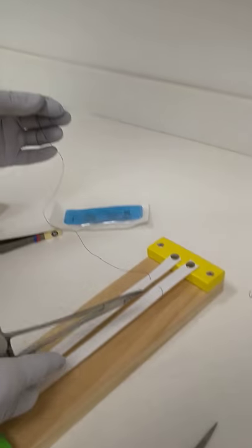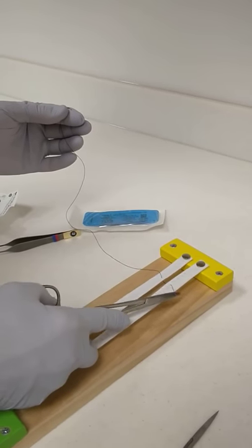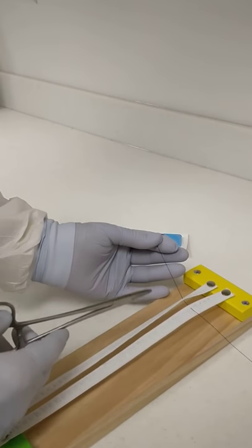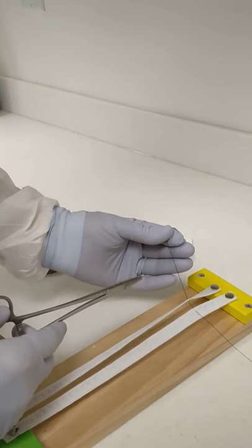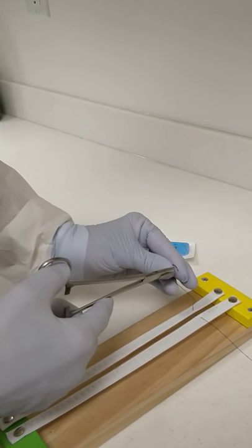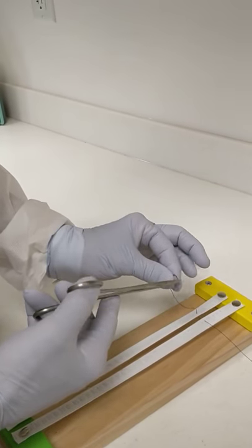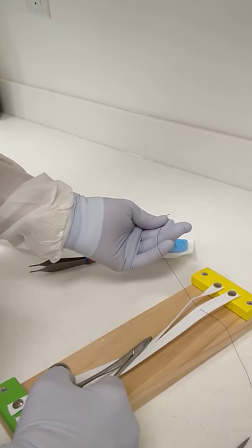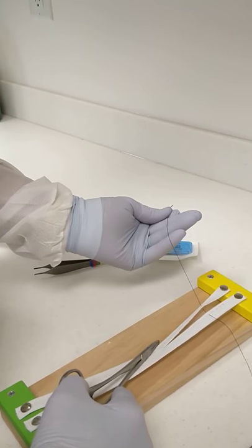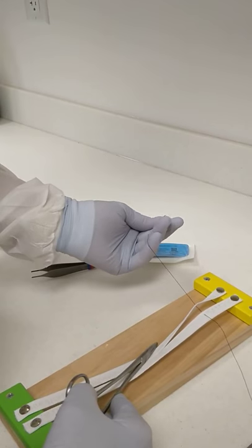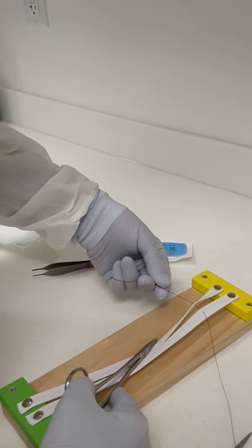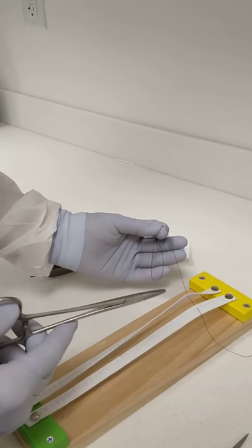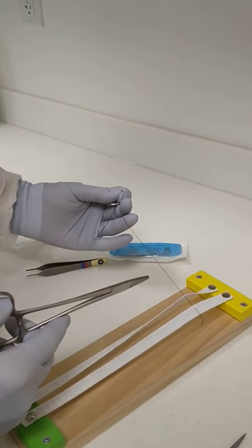One of the most difficult things for students to learn is how to handle the excess suture material. There's a procedure which we call palming, which involves taking the needle by the back end, pulling it through the tissue with your little finger across your hand like this, and picking that free end up between your thumb and forefinger until you get to the right length that you need.